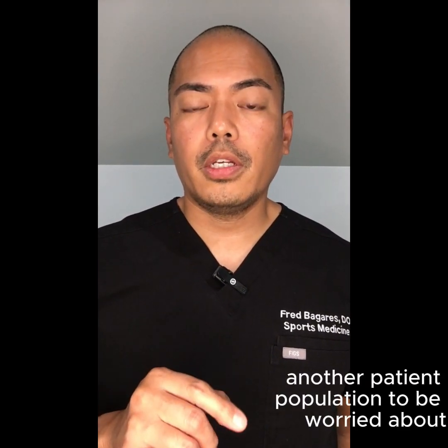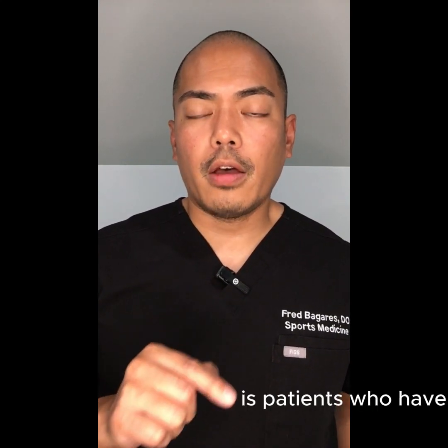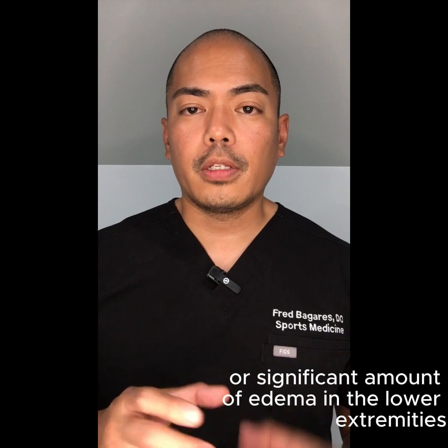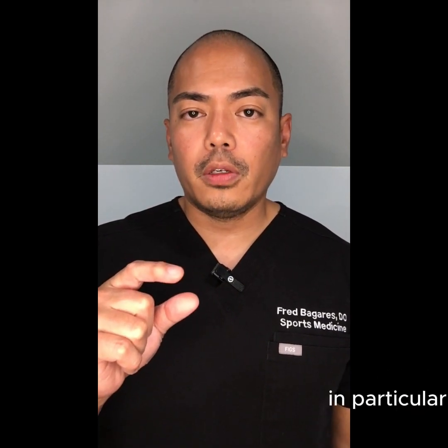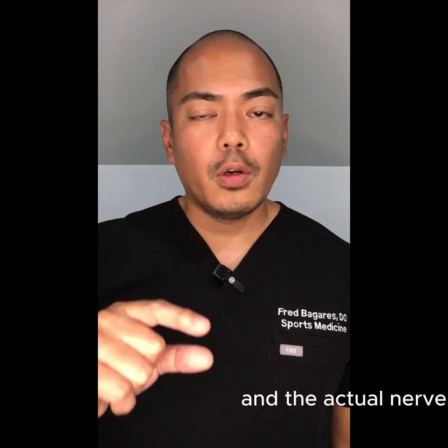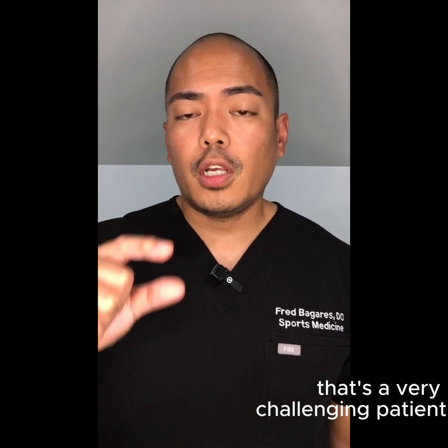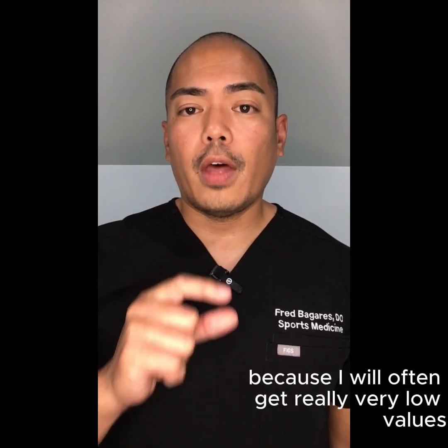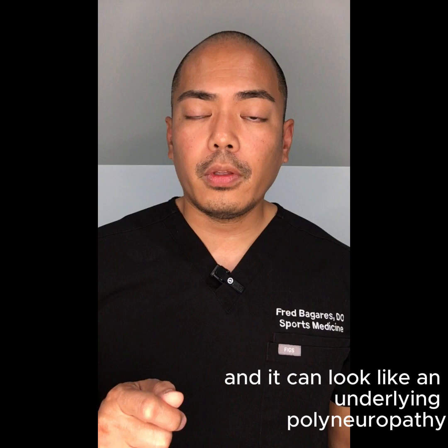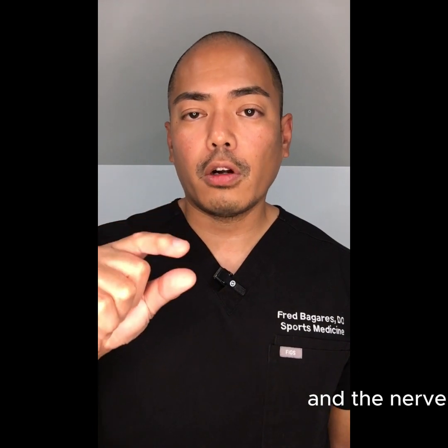And another patient population to be wary about referring for EMG nerve conduction study is patients who have very large diameter calves or significant amount of edema in the lower extremities. The nerve conduction study in particular, I use these surface electrodes. And if there's a lot of distance between the surface and the actual nerve, whether it be from soft tissue, edema, or sometimes even just frankly dry skin, that's a very challenging patient because I will often get very low values, if not sometimes even no values. And it can look like an underlying polyneuropathy, but in actuality, I'm not actually able to test the nerves because there's too much distance between the surface and the nerve.